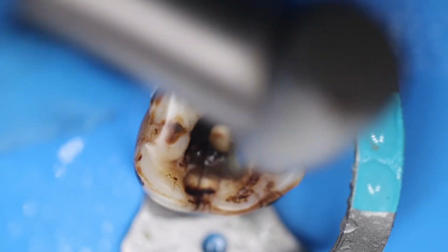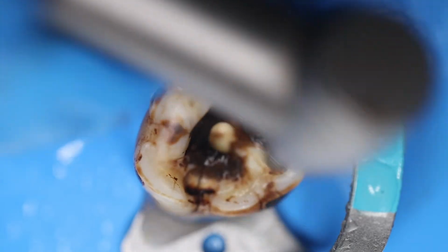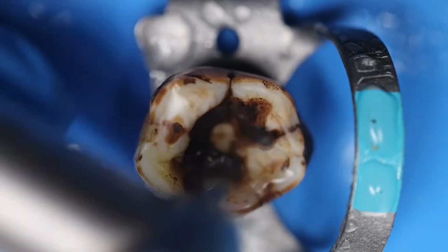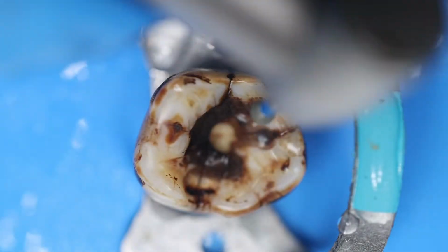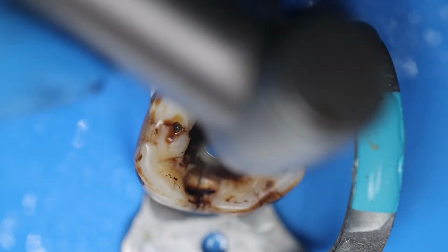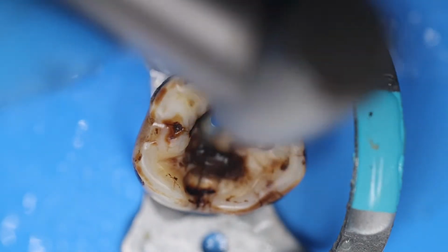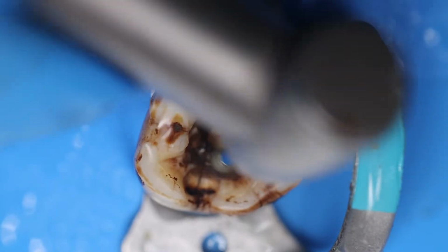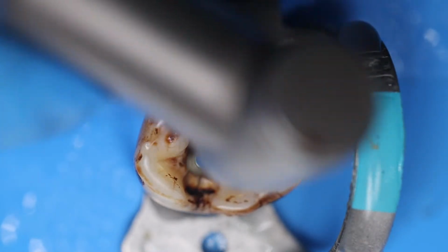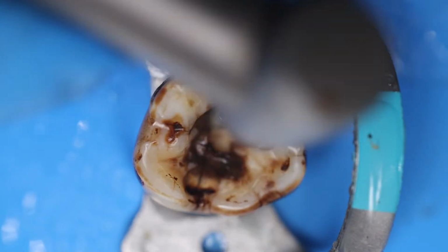See, the idea behind this is to gain the proper access shape as well as remove all the caries that is there. Otherwise, if we don't remove the caries and we just focus on the access cavity shape and do the best of the root canal, then also we are going to fail in our treatment, as caries will progress and this will ultimately lead to failure of the root canal. So we need to remove the caries simultaneously as we are going into the pulp chamber.